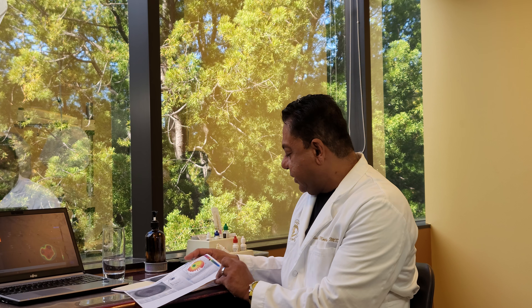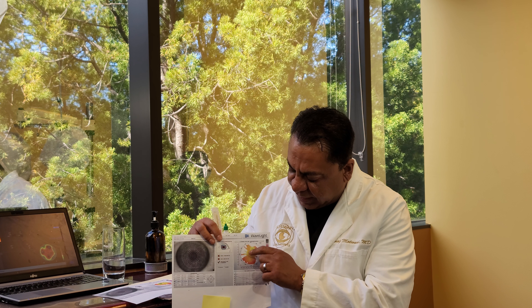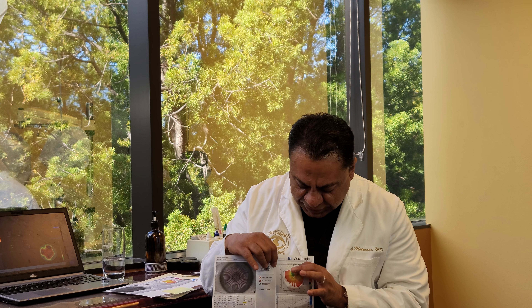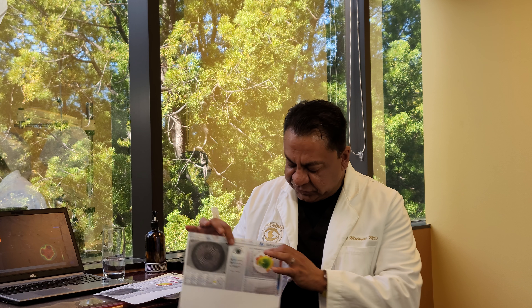And it's pretty remarkable. Here's a patient that had a pretty irregular cornea — the flat spot is all the way here, kind of almost like a keyhole. This is their pre-op for their right eye, and this is six days later. That's a completely different shaped cornea, just six days after the procedure. The other eye is perhaps even more irregular, with a flat spot all the way up here instead of the center, and this irregular shape through here. And this was six days later — we made this round, smooth shape, and that's all still with healing epithelium.